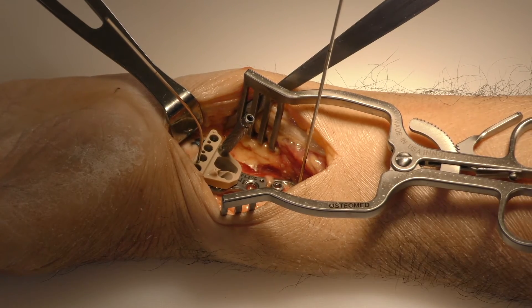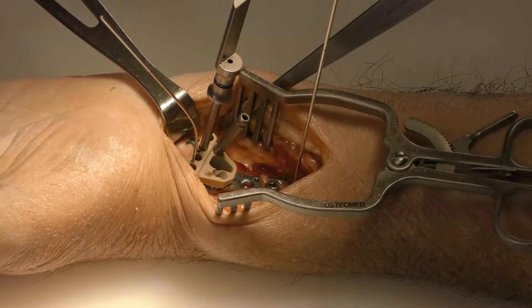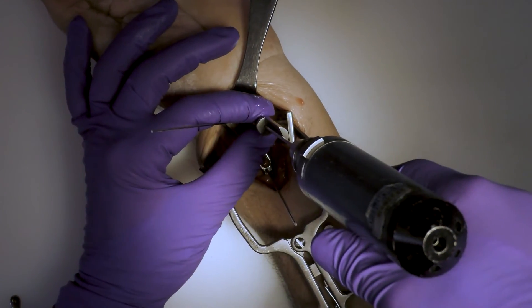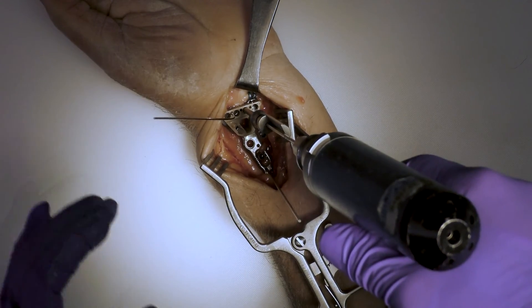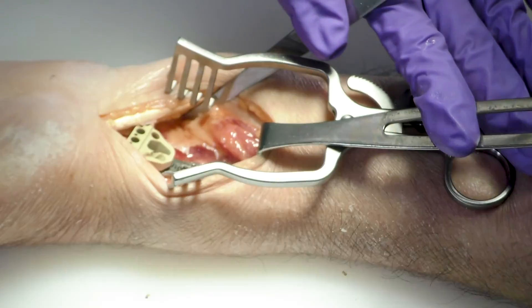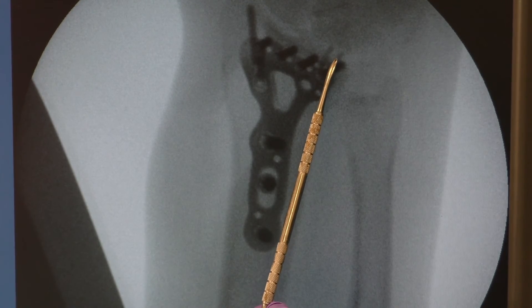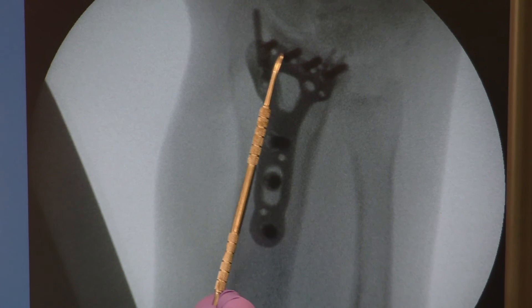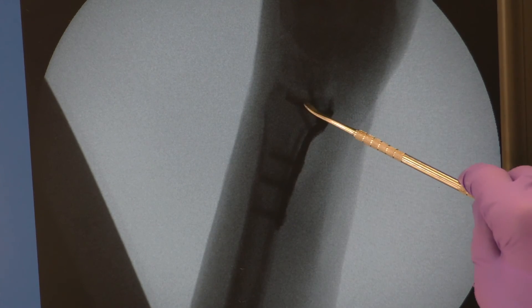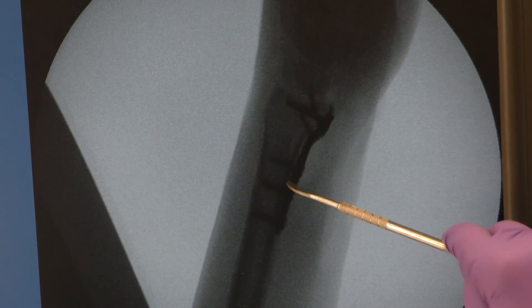At this point I like to fill in the rest of my distal row. I will have my scrub tech and my representative pre-measure screws based on preoperative imaging on the back table. I will drill all of my screws in the distal row at once and then proceed with filling them all at once. At this point we will switch to the proximal holes. Remove all of your provisional K-wire fixation and your PEEK guide, then take your final fluoroscopic images. You can see the two tines of the volar hook plate, adequate screw placement beneath the subchondral line of the distal radius, and a centered position of your volar distal radius plate. On your lateral view you can see subchondral screw placement of your distal locking row, your styloid screws, the two tines of the avulsion hook plate, and your fixation proximally.